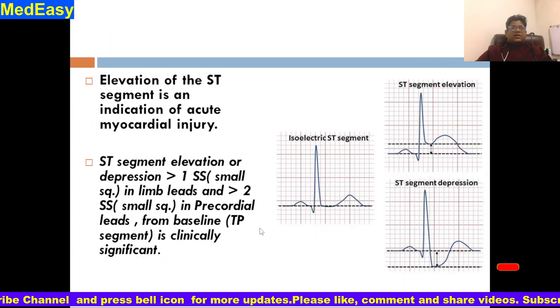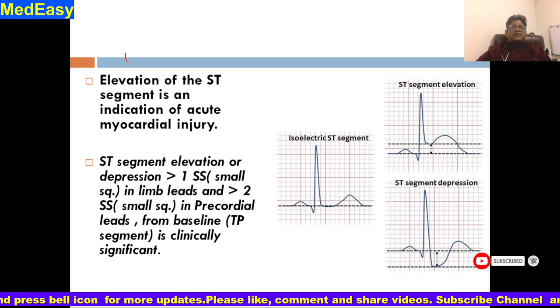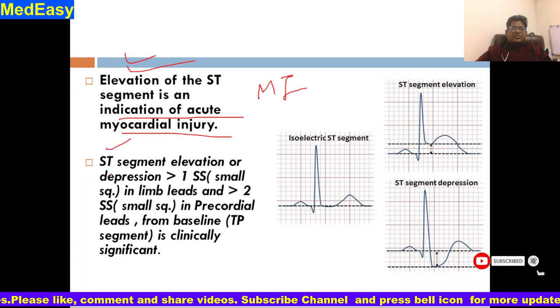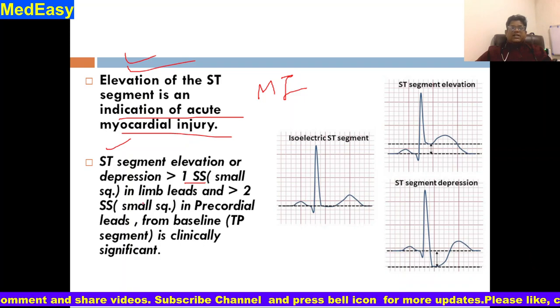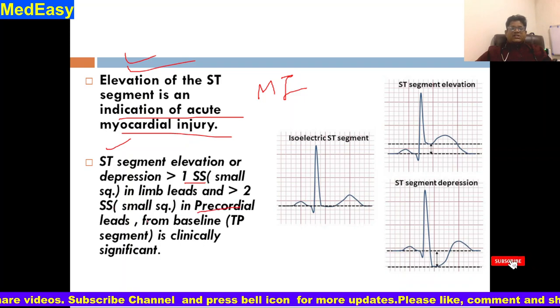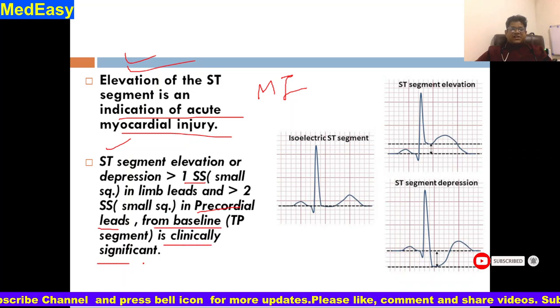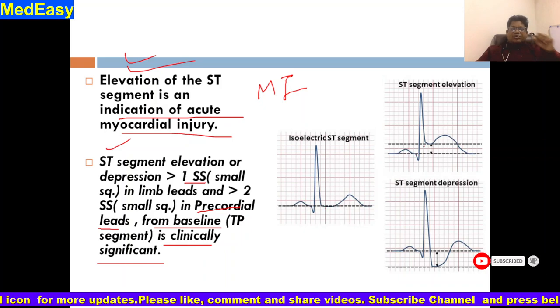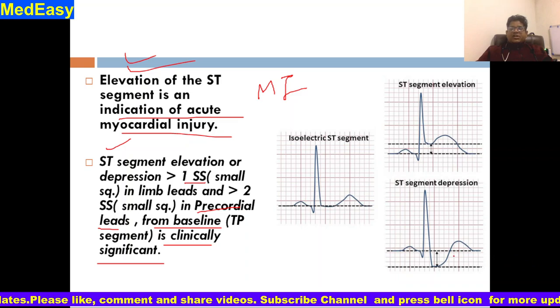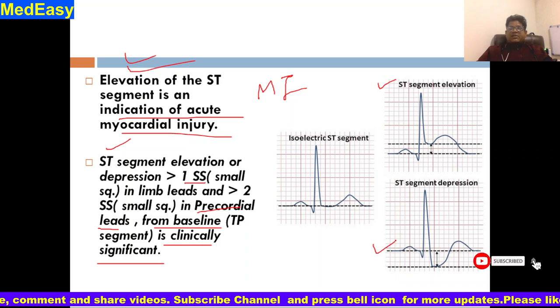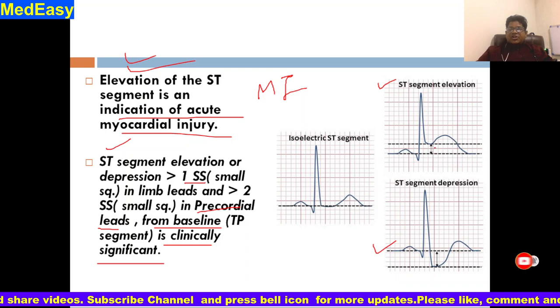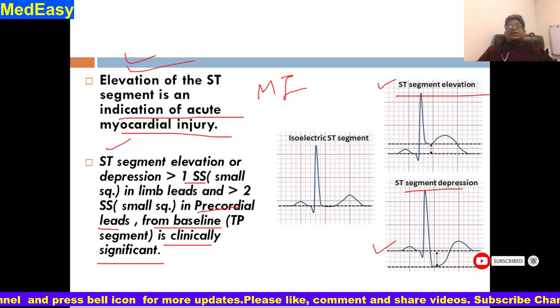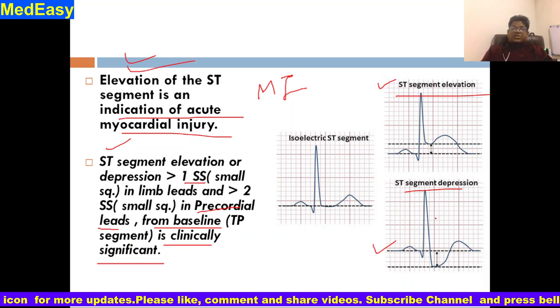ST segment elevation is an indication of acute myocardial injury and myocardial infarction. ST segment elevation or depression of more than one small square in limb leads, and more than two small squares in precordial leads from the baseline — which is the TP segment — is clinically significant. So this is a typical pathological condition representing a significant ST segment elevation.